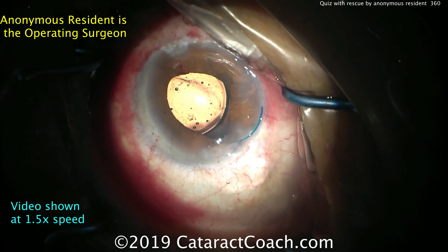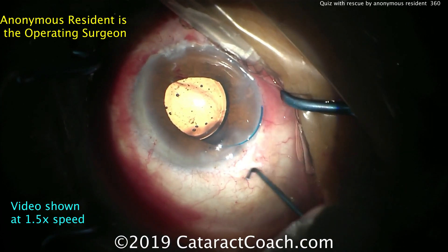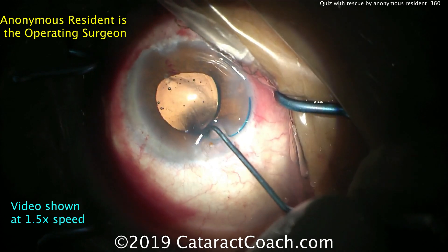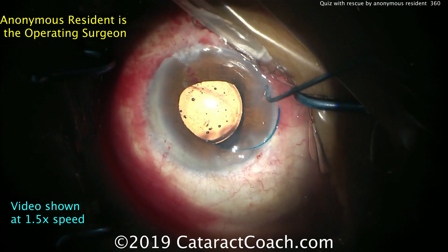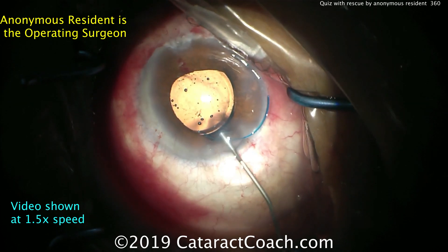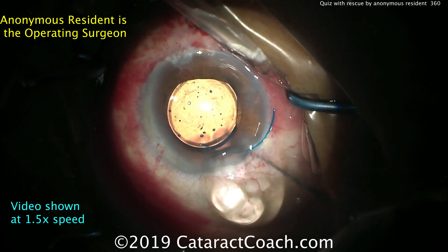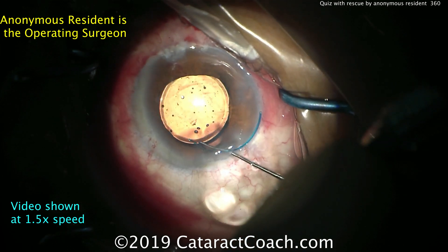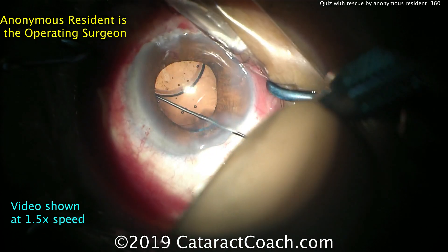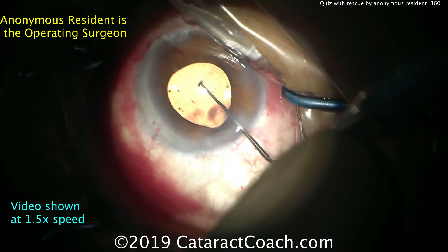Great save there by the resident. Why is it so important to have the lens in the correct orientation instead of upside down, especially for a three-piece sulcus lens? The answer is that these three-piece lenses are not planar or flat — they're angulated. There's usually a 10-degree angulation between the haptics and the optic.